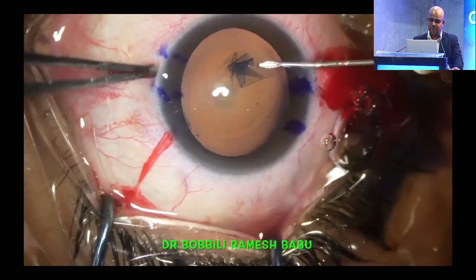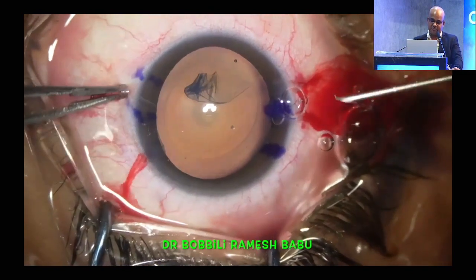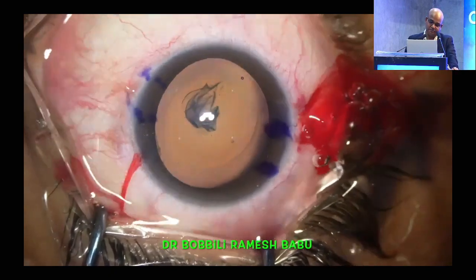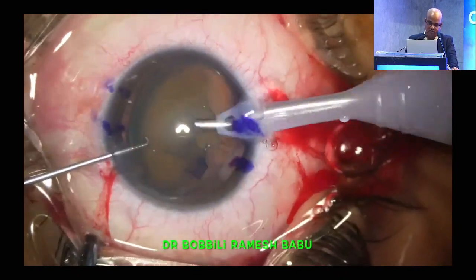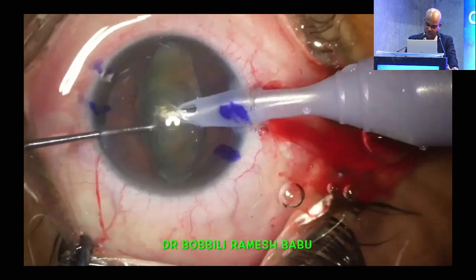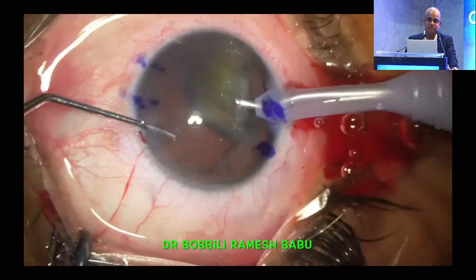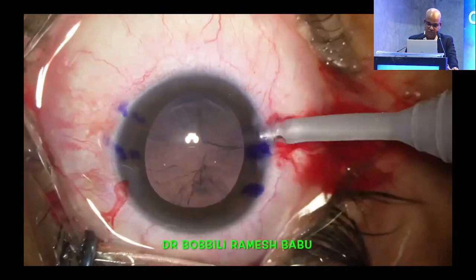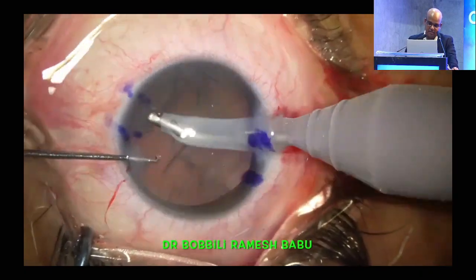Because of the viscoelastic, there was a tendency for the rhexis to extend to the periphery. In these lenses, especially torics and multifocals, the rhexis should not run away. So hydrodissection is done, and by the flip and chop maneuver, phacoemulsification is being done. We need to protect the endothelium sufficiently, which we can do well with the help of dispersive viscoelastic. Cortical aspiration is being done with coaxial IA.